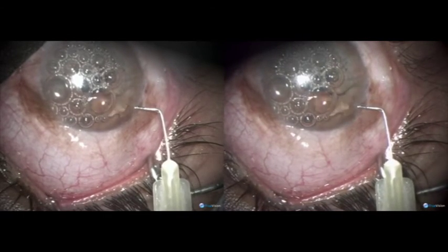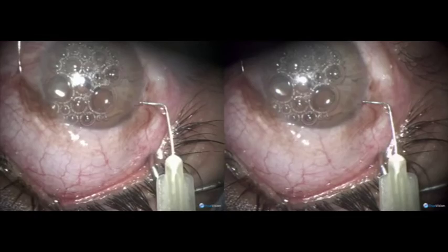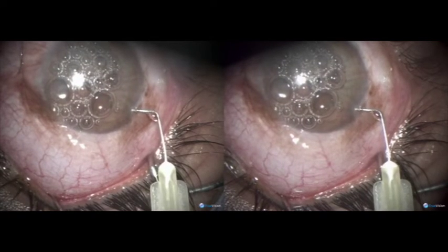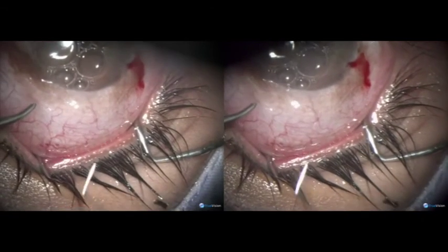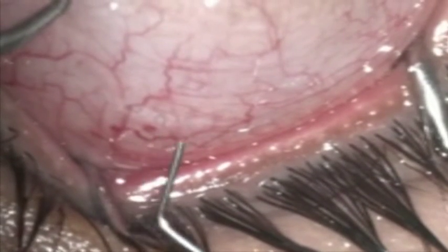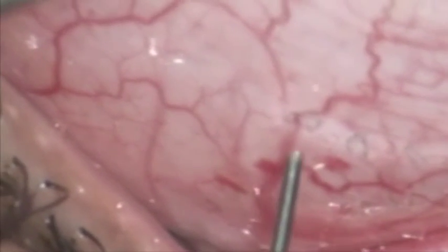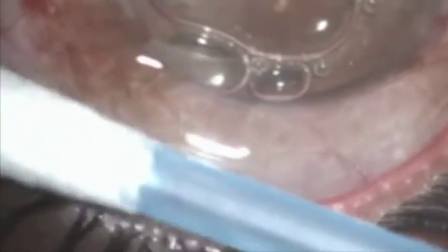The surgery is basically finished. The whole film is at half speed. Now we look at the conjunctival holes, and you will find that these holes are very clean — there is no collateral burning or charring of the tissues. Very clean holes, far away from the limbus, and we are not applying any suture.